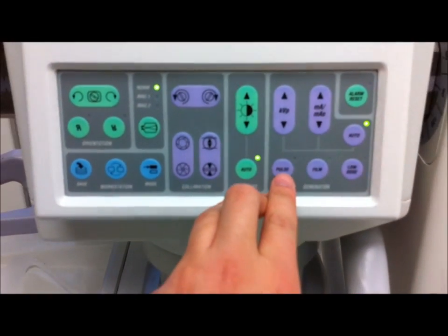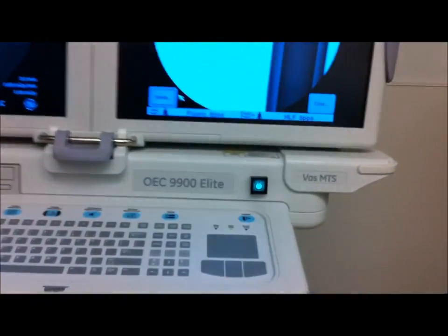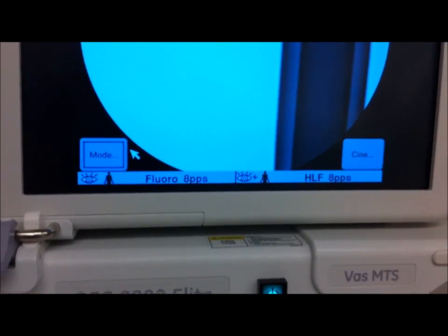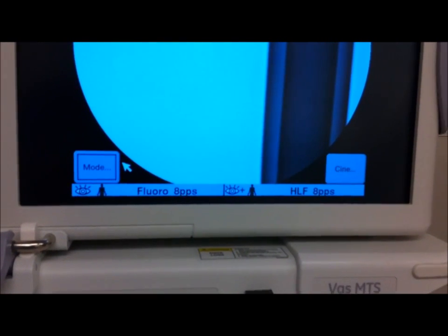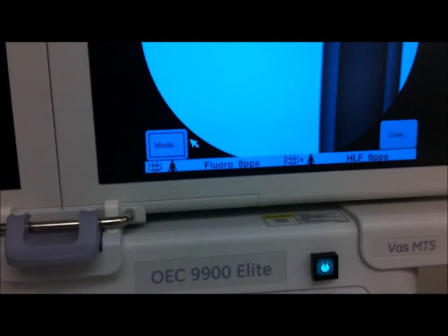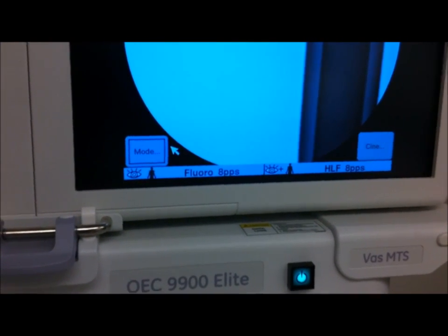If you hit the pulse button here, what this will do — and you can adjust this too — is fluoro at eight pulses per second. Basically, instead of continuous fluoro, which is roughly equivalent to 30 frames a second, this will do it at eight frames a second. What this does is it creates a slower motion fluoroscopy video, but the nice advantage to this is, of course, patient dose reduction.